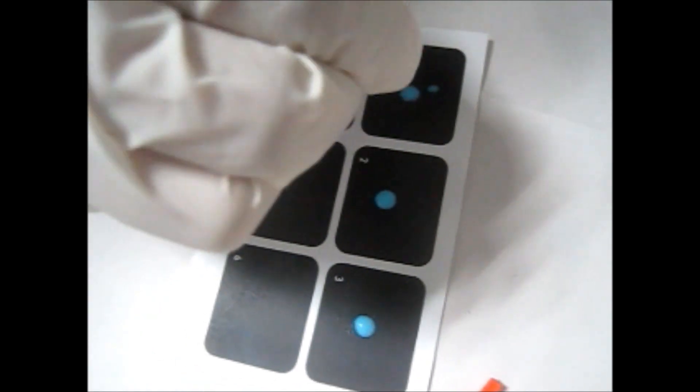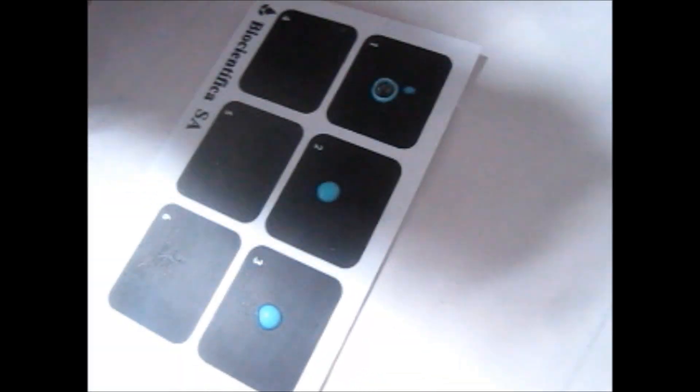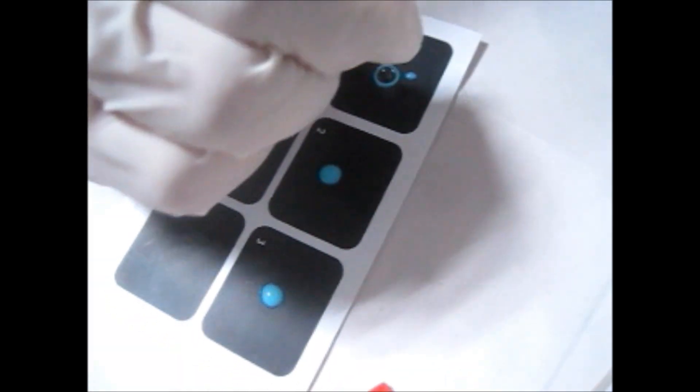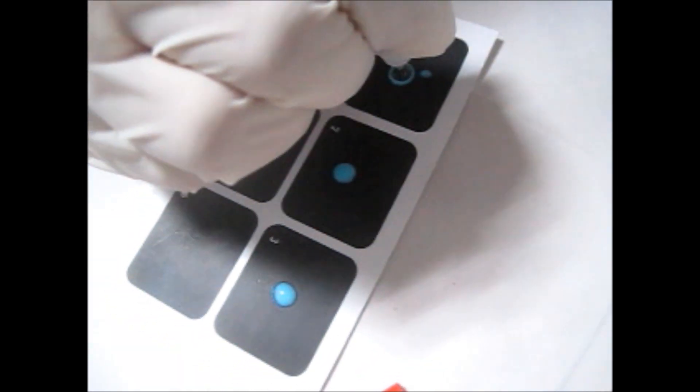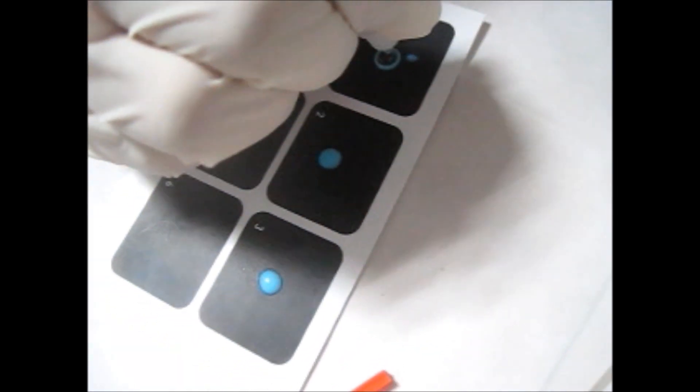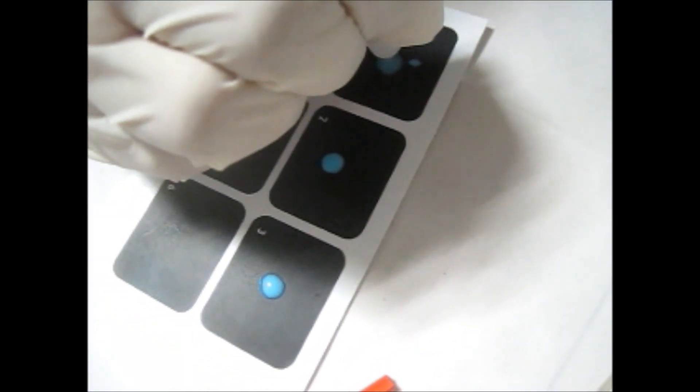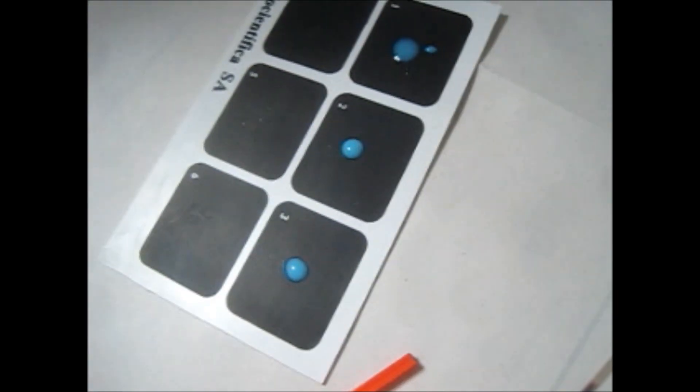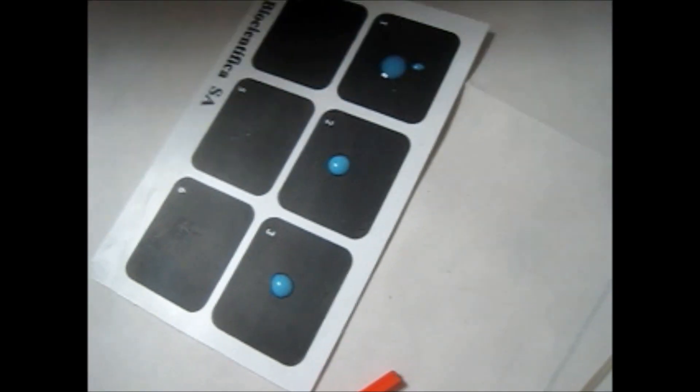On number one, add one drop of positive control and mix it with the help of a stick. When you mix it, agglutination will occur.